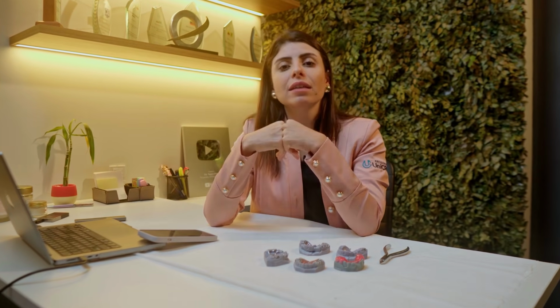And in those cases where you're going to use a new expander, after waiting 4 or 5 months, you can then start a new maxillary expansion, okay? But it's actually a mistake. It qualifies as a mistake if this problem happened because you didn't activate it enough.